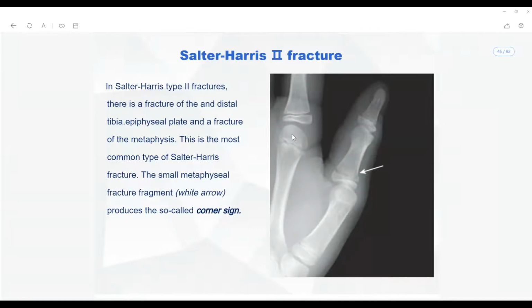Compared to the other bones, what actually happens is that they show up as a provisional zone of calcification along with the zone of ossification securely attached to each other.